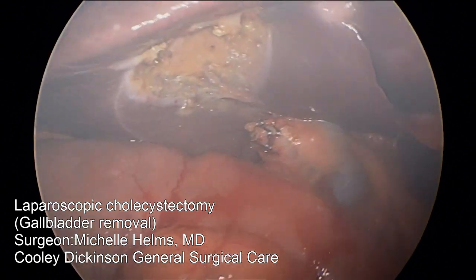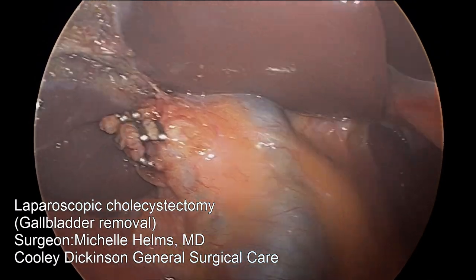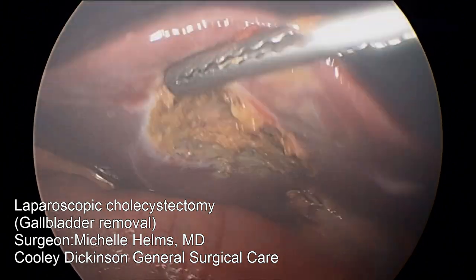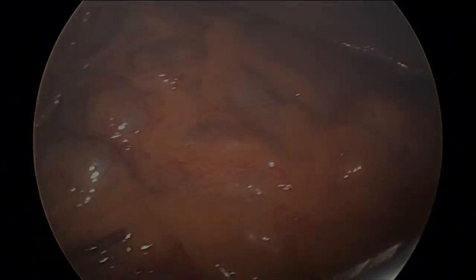That's the liver — we're back in to re-inspect the work. We make sure there's no bleeding or any trauma to the surrounding organs. It's a very careful look before we close everything up. That's the liver, and that's the omentum — a little bit of fat that covers all your organs inside your body.